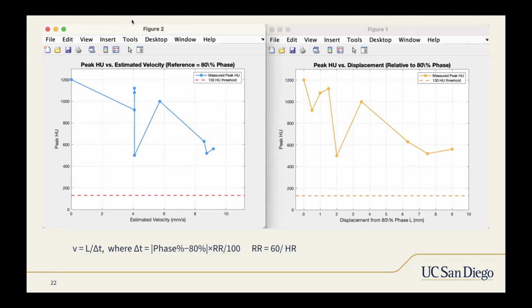Is that systole? That's where it's moving really fast first. So it's at displacement 2 millimeters? Yeah, I'm looking at the right orange curve at the point where it's 2 millimeter displacement. This is at like 40% phase. That's probably not when the heart's contracting, but when it's refilling, right?